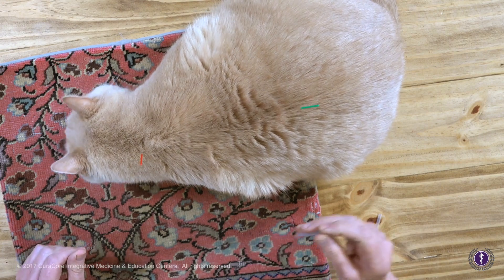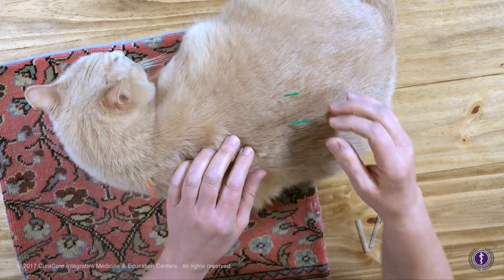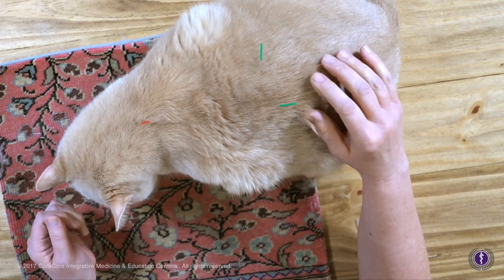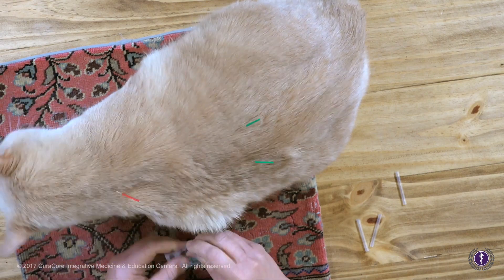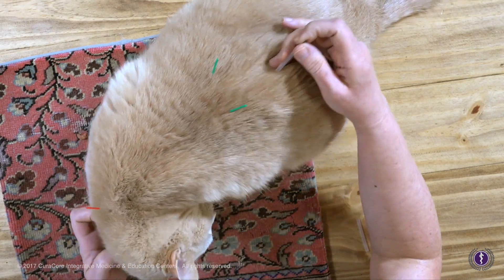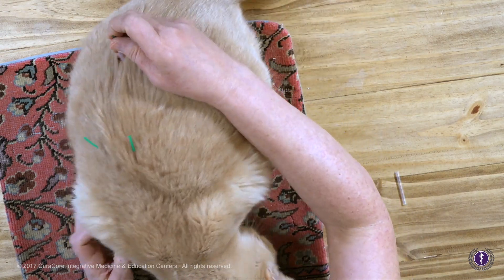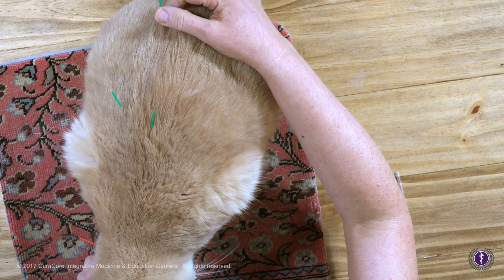Sometimes with cats what they'll do is start to shake things out if they're a little uncomfortable. He's noticing those needles — yes you are, it's okay though. Sometimes they shake things out. Here's another little tender and warm area — and there we go.